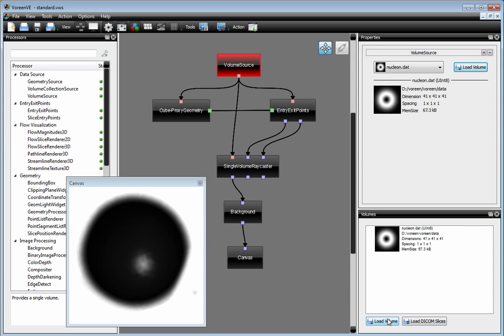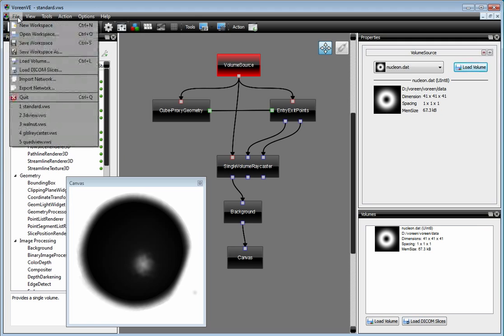If you have compiled Voreen with DICOM support, you can also load DICOM slices here or directly here from the menu.